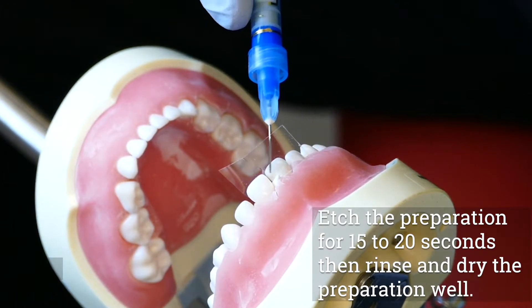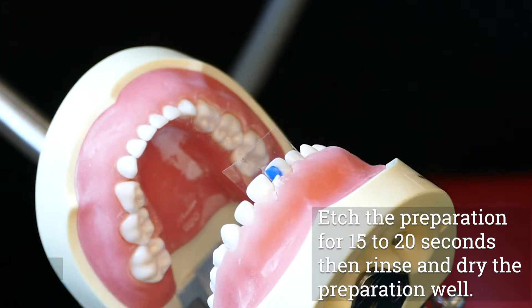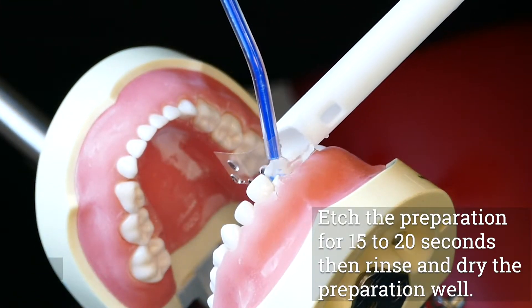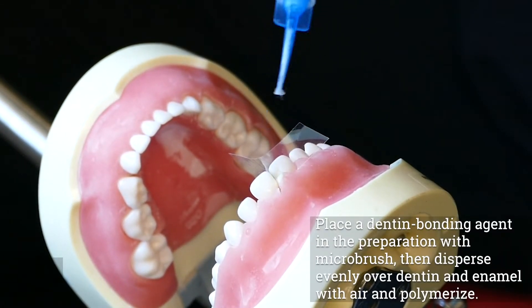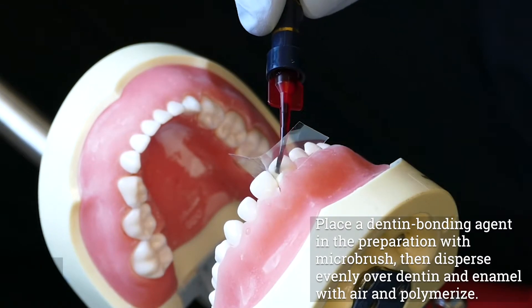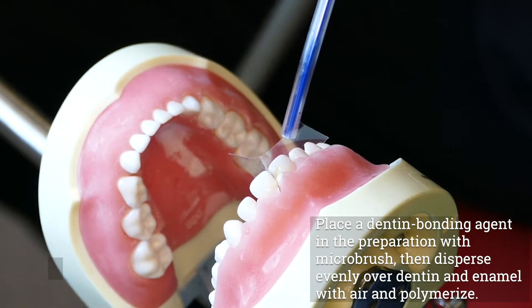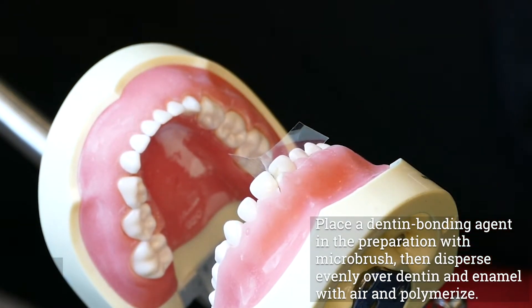Etch the preparation for 15 to 20 seconds, then rinse and dry the preparation well. Open consepsis and dry with air. Place a dentin bonding agent in the preparation. Gently blow compressed air into the preparation to disperse a thin layer of bonding agent evenly over both dentin and enamel. Polymerize the bonding agent.